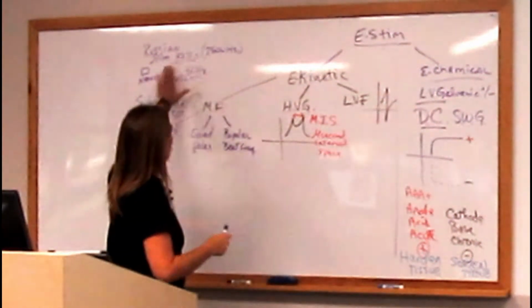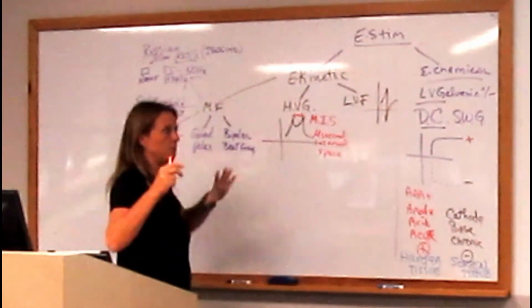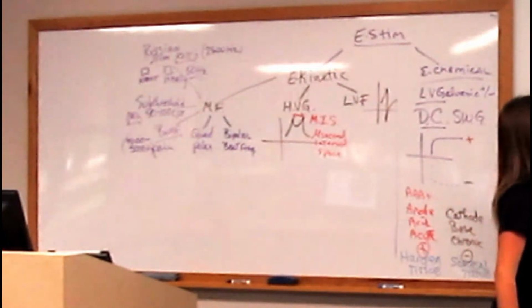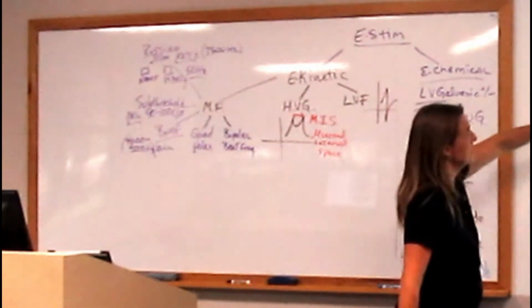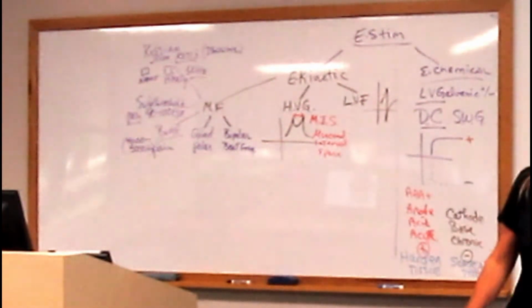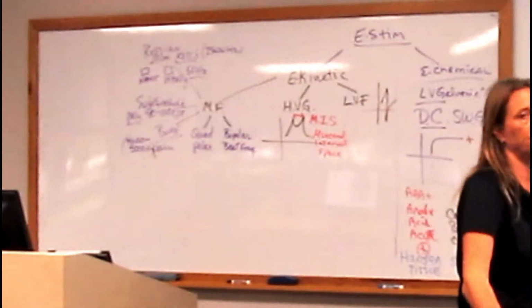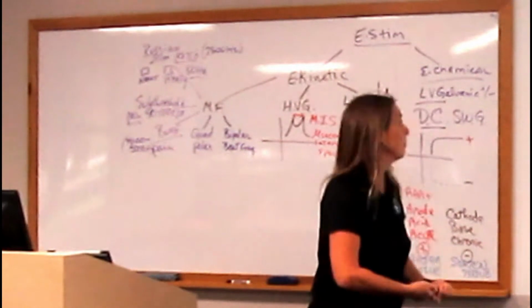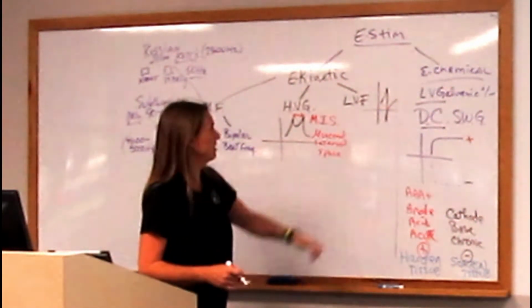Now, I'm not going to talk more about those medium frequency things because I want to focus in on right here, the part that seems to confuse people. Which modality should I use? Should I use a high volt? Should I use interferential? Should I use pre-mod? This particular machine does not offer a low volt faradic. So I have in my PT lab all of these different machines, old machines, new machines, and I have to figure out which machine I'm going to use. So in this case, I'm going to figure out which one of these 3 to use.